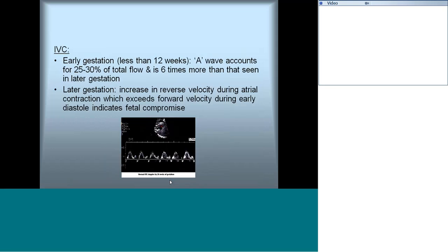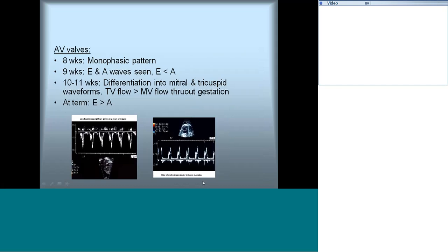The IVC Doppler is similar to postnatal IVC Doppler; however, early in gestation the A wave accounts for 25 to 30% of the total flow — you can see the X, V, and A waves. Later in gestation, if the A wave velocity is much increased during atrial contraction, it indicates the fetus is compromised. AV valve inflow patterns start as monophasic early in gestation, then develop separate E and A waves by around 19 weeks, where the E wave is less than the A wave in velocity. Tricuspid valve Dopplers have higher velocities than mitral valve inflow Dopplers, and this continues throughout gestation.